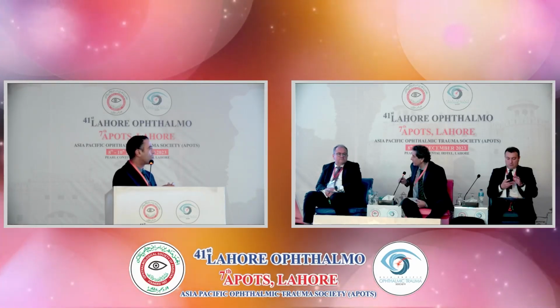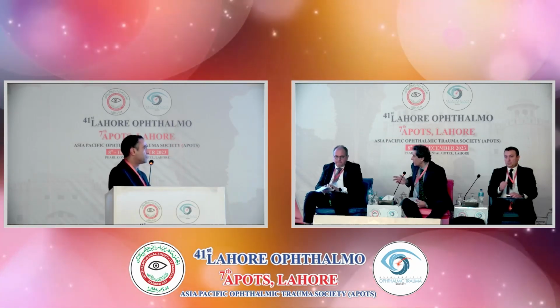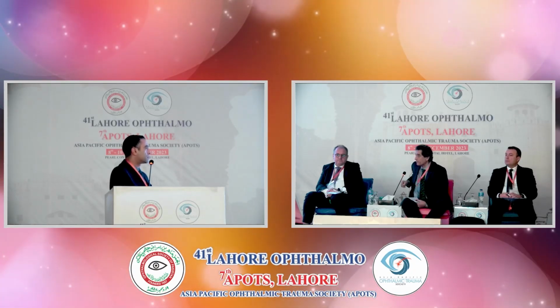That's why I was asking, what do you think is an ideal place for the selection of the graft? The selection is upper temporal, after the upper temporal arcade, as close to the arcade as possible, I think. And the selection of the size is also very important. It should be slightly bigger than the 1,700, because it tends to shrink, and I've even seen it slipping behind the retina through the hole. So the size should be bigger than the size of the macular hole itself.